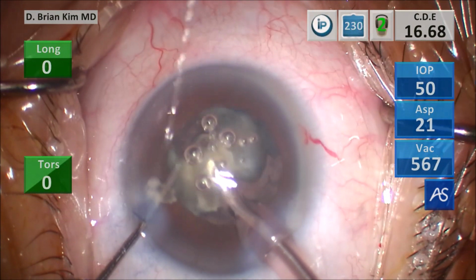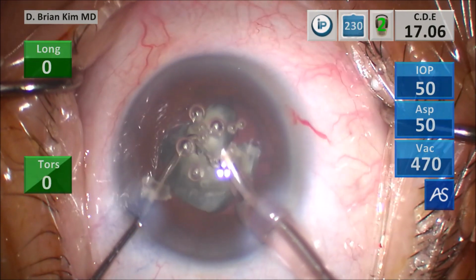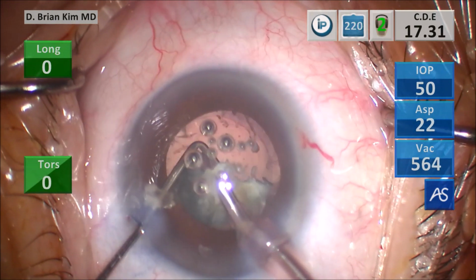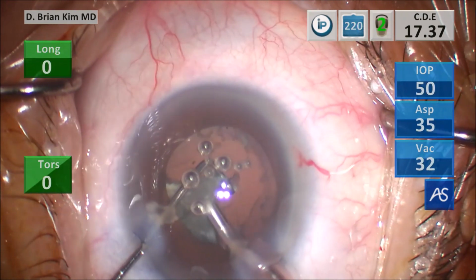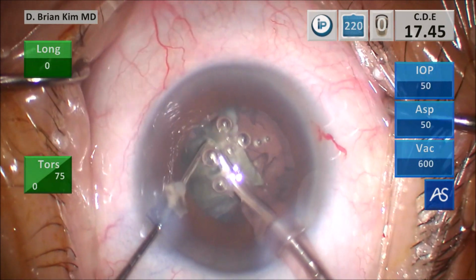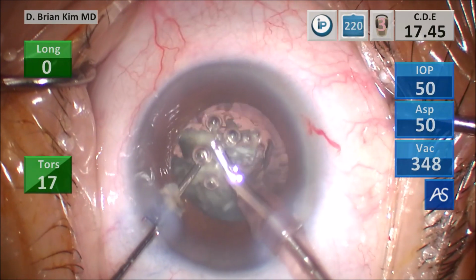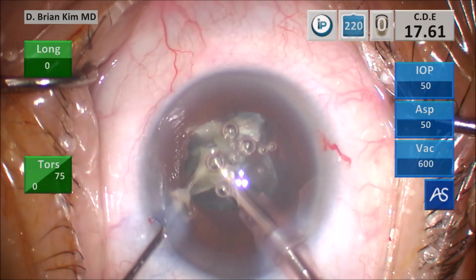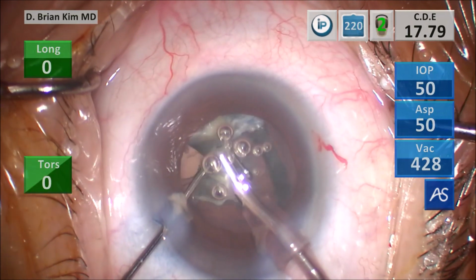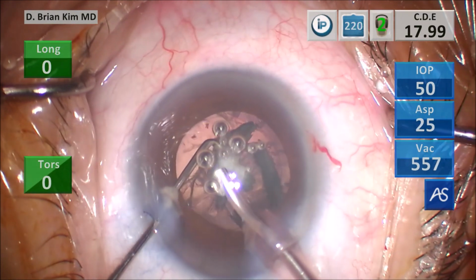But if you're one of those guys that's having corneas that are clear sometimes, and then other times you have steamy corneas, and you're really just baffled as to why you have this happen, this is why. It's because your corneal endothelium is not protected. It's not that difficult of a concept. Because the dispersive viscoelastic is invisible, it's hard to really appreciate that. So you can see here, as this case has progressed, those bubbles are still there. I mean, they're essentially the same place as they were at the beginning of the case.